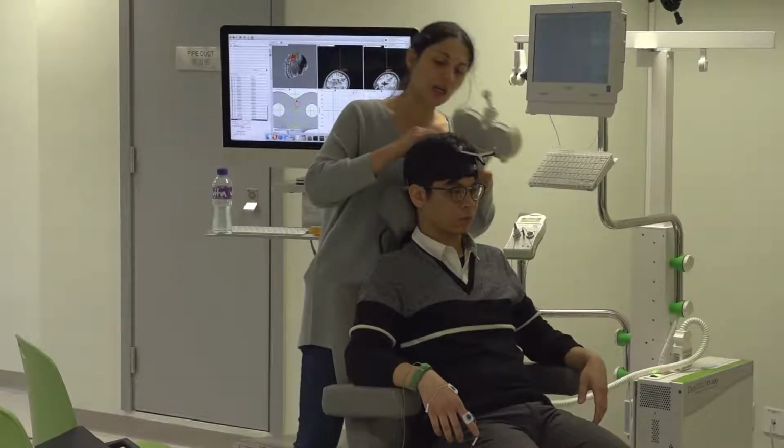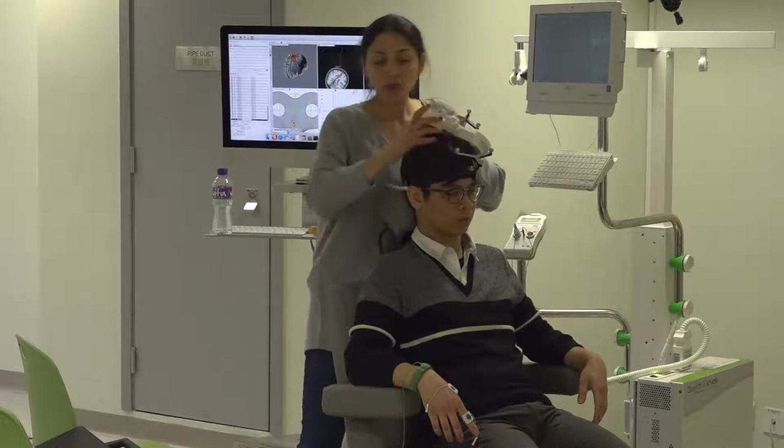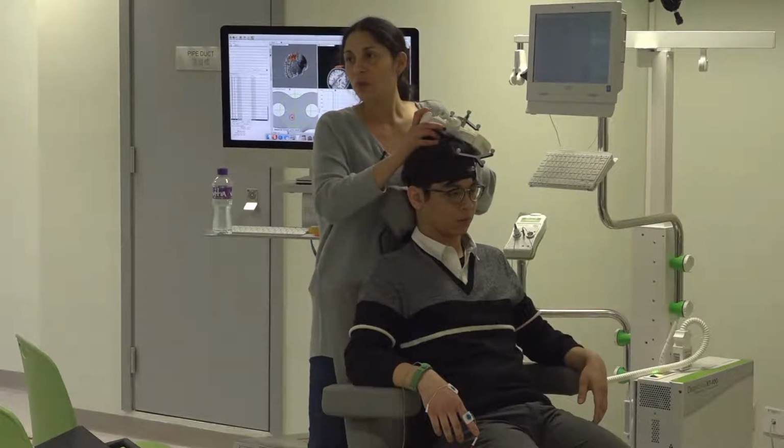And I see the 2 fingers are moving. Is that the hotspot? No, I'm trying to find actually which one is the right spot. So it's taking a lot of time. I don't know why. Normally it doesn't take so long for me to find a spot where the motor cortex is stimulated. What I'm trying to do is sending one pulse, waiting 5 seconds, and then stimulating again.